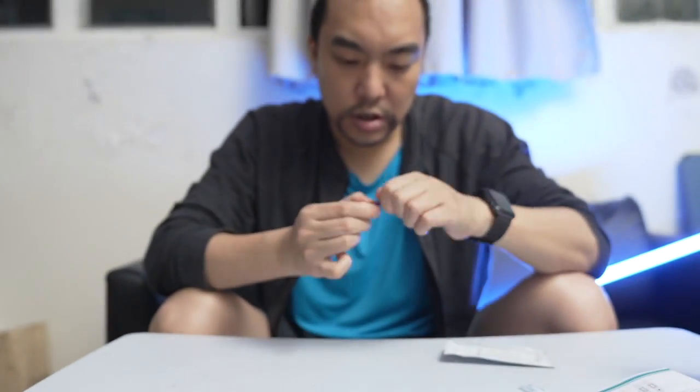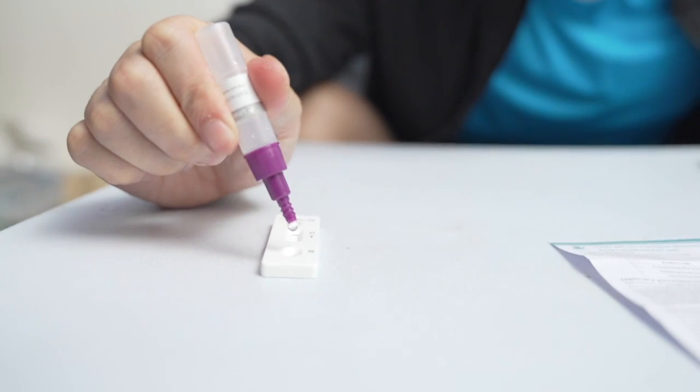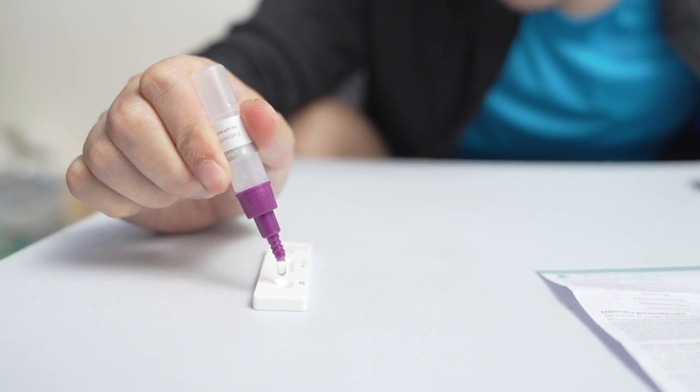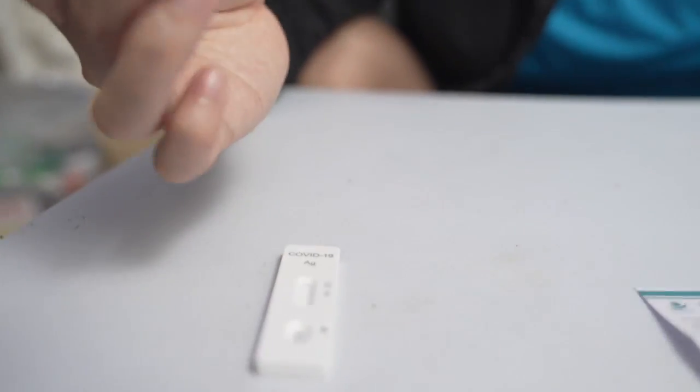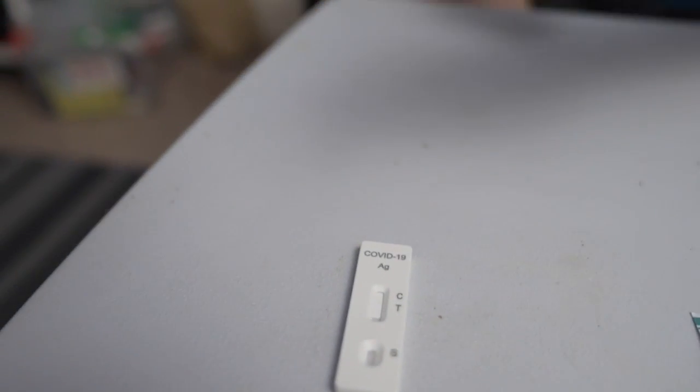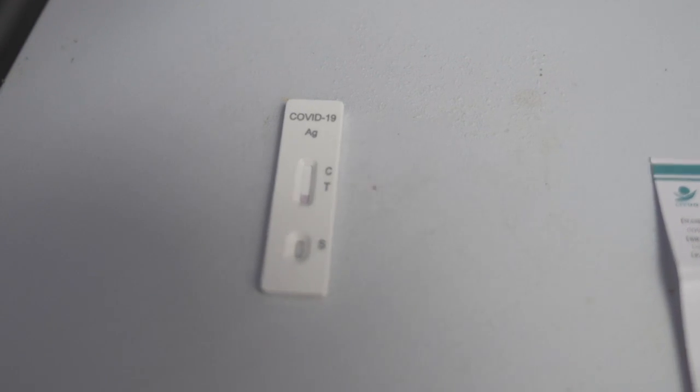So I'm going to do that now in the COVID AG test. Isn't AG silver? So they say you only do 2 drops, otherwise it's invalid. So that's 1 drop and 2 drops, and that's it. I guess I can keep this cool bottle for other purposes. Maybe I want to put stuff in it.